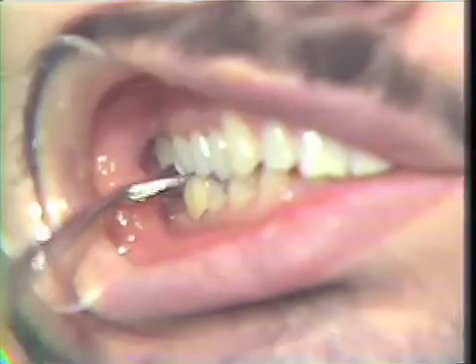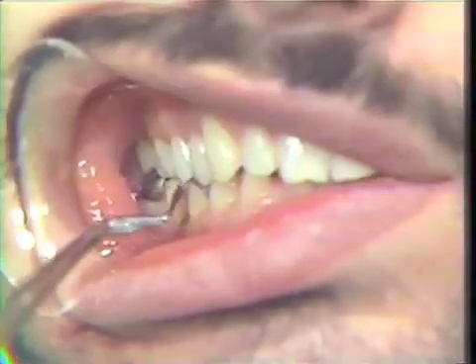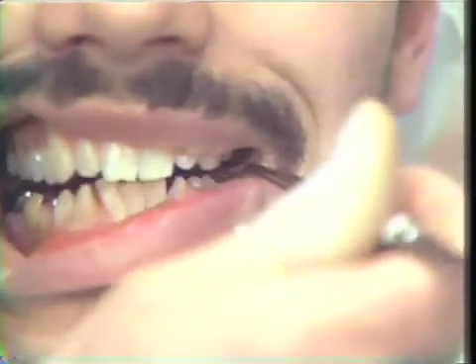Seems to be a little bit light. No, we have good contact there. And back together once more, please. Fine. And just a little bit light in that area. And we'll check our centric stop over on this side. Bite together, please. Good. And we still have maintained that on the opposite side of the arch.